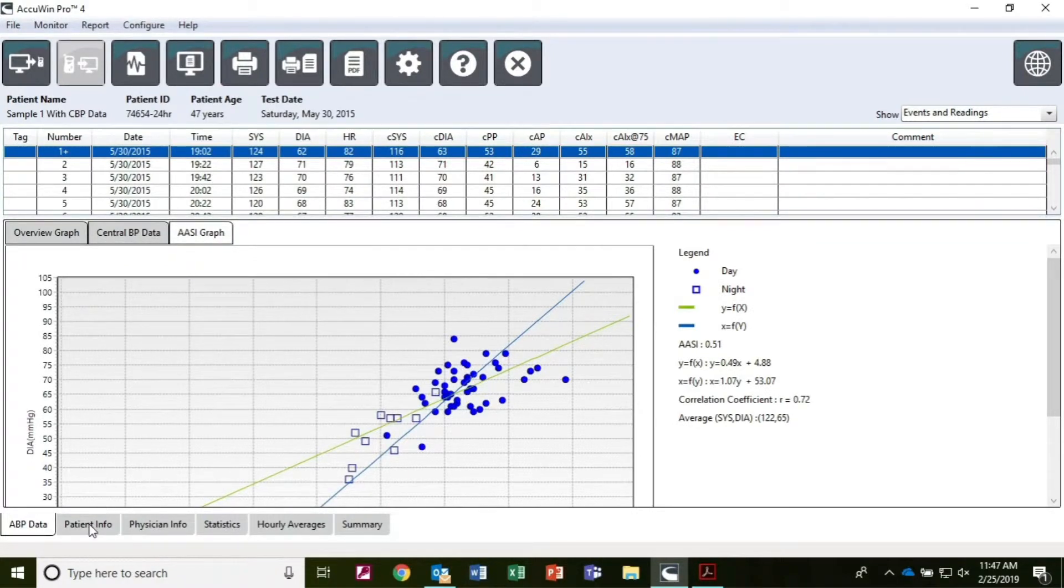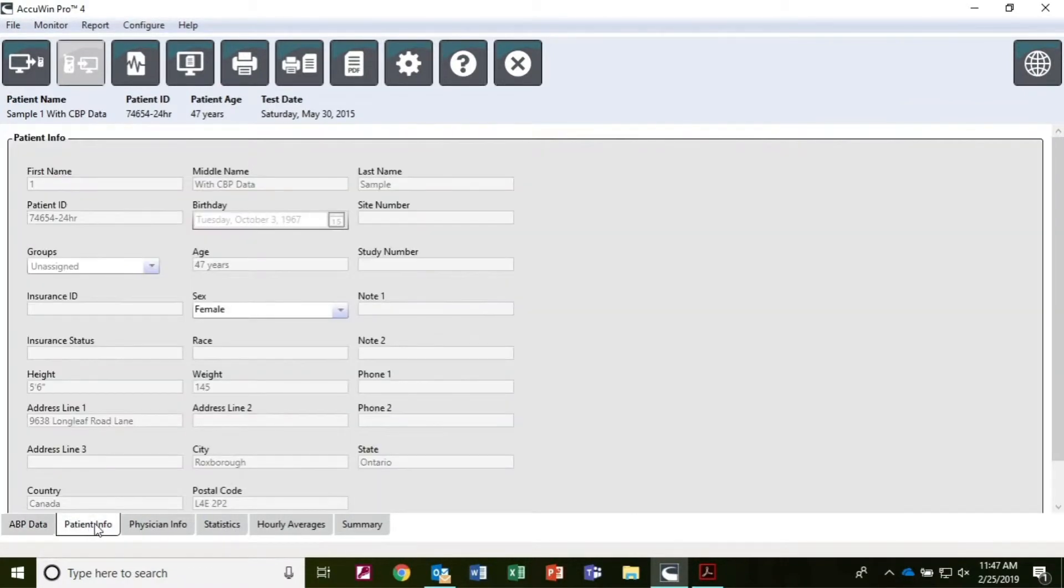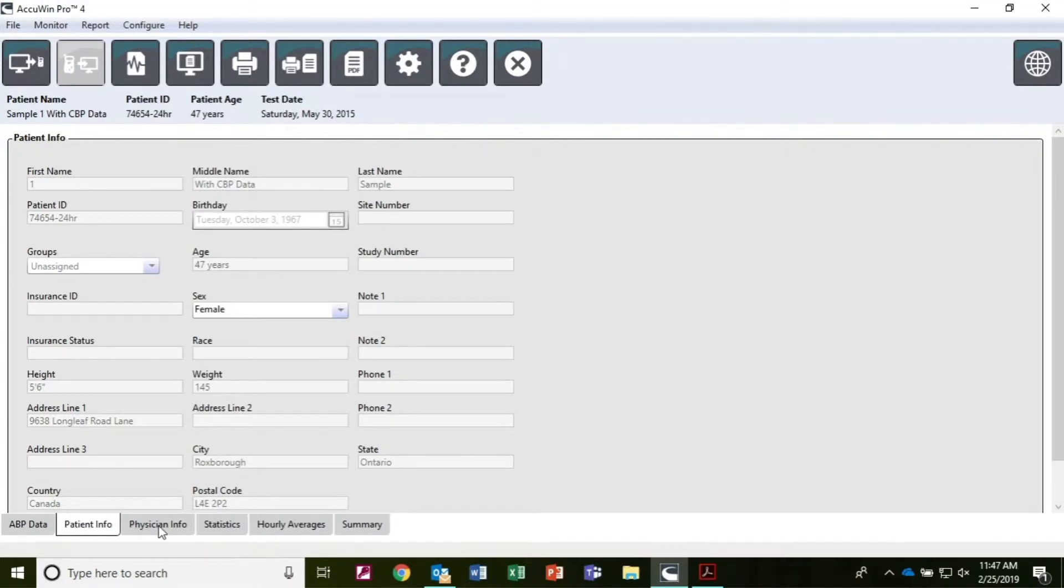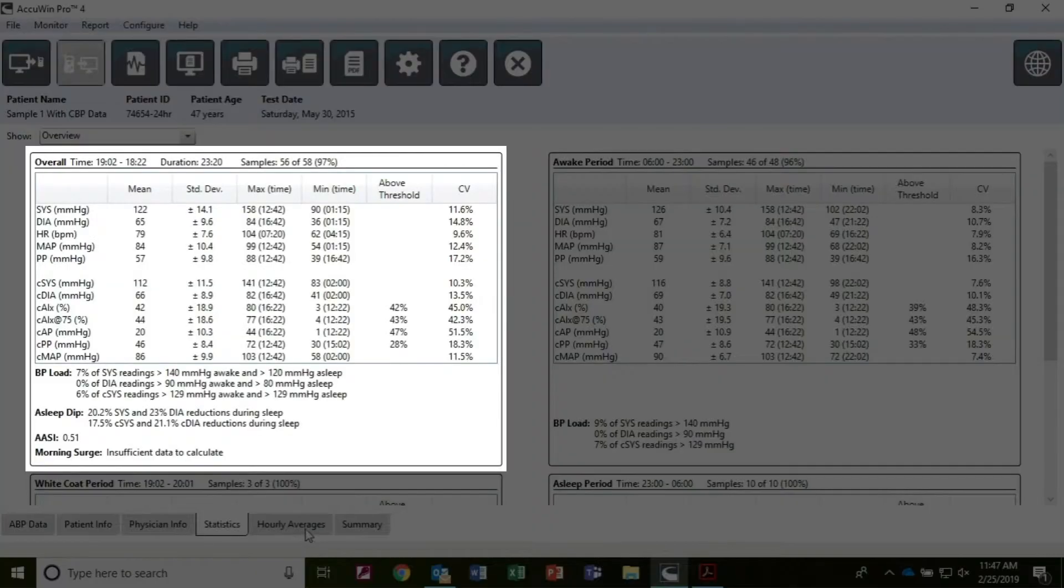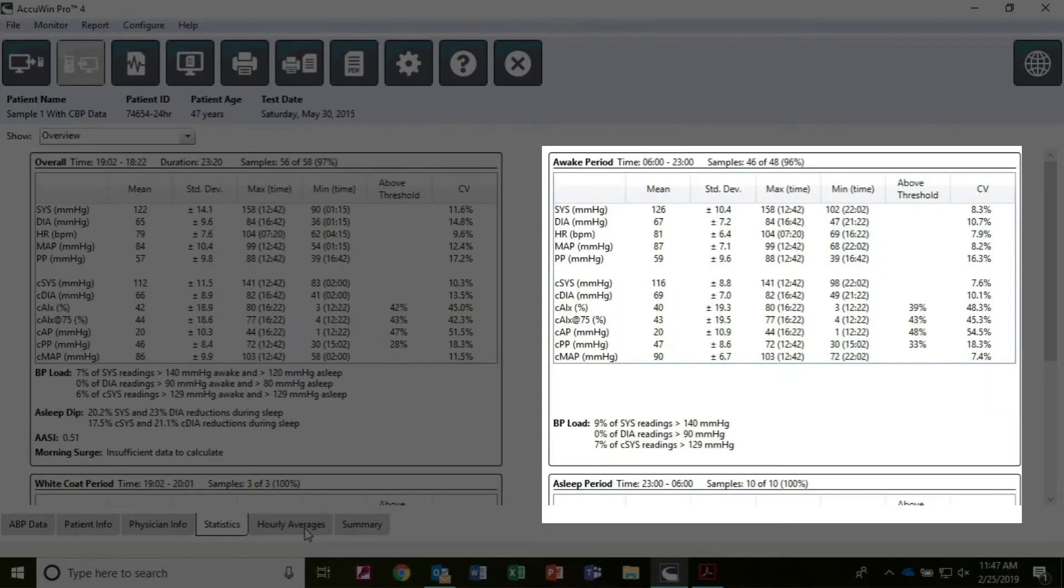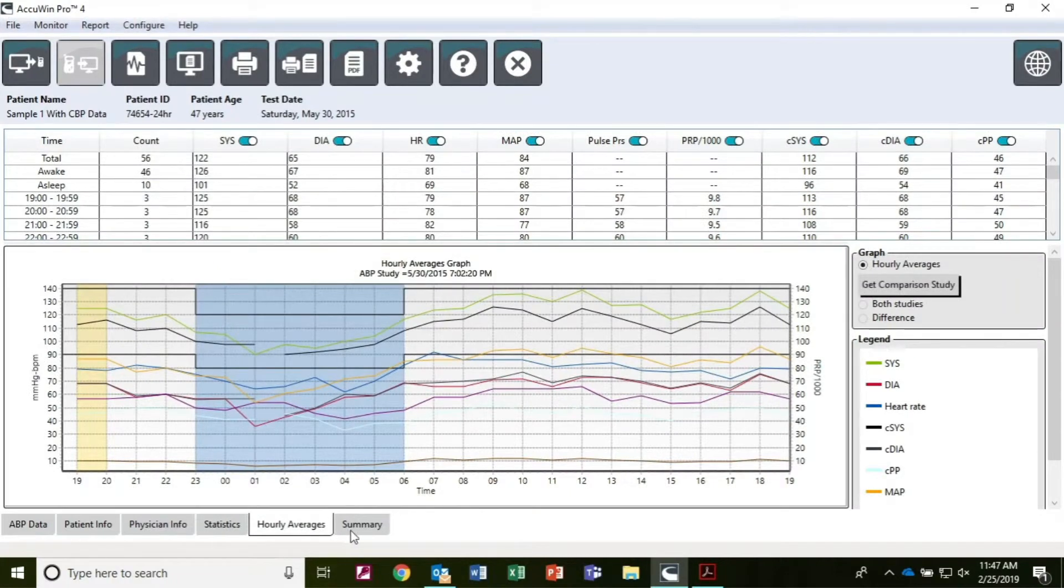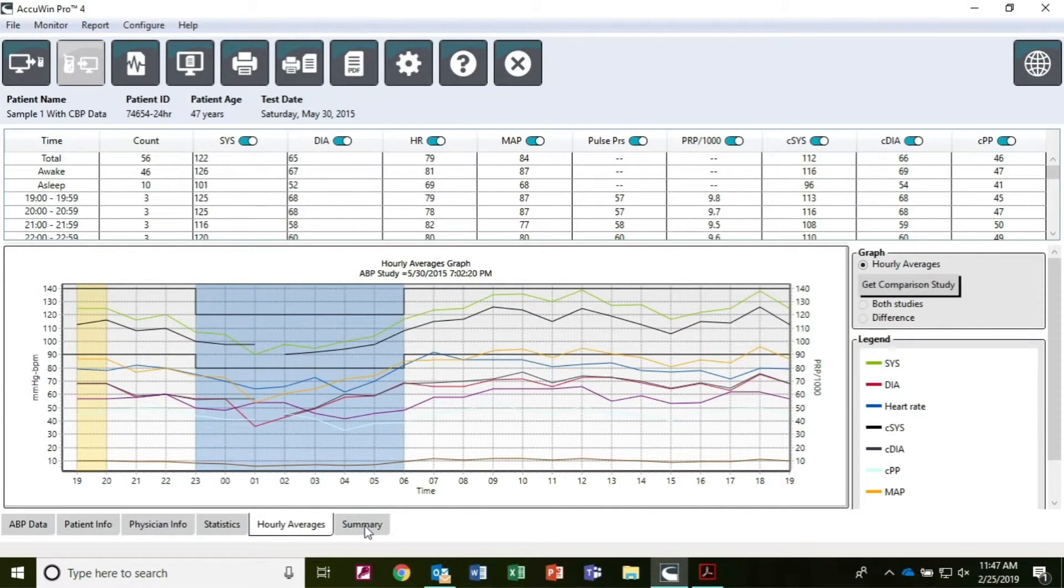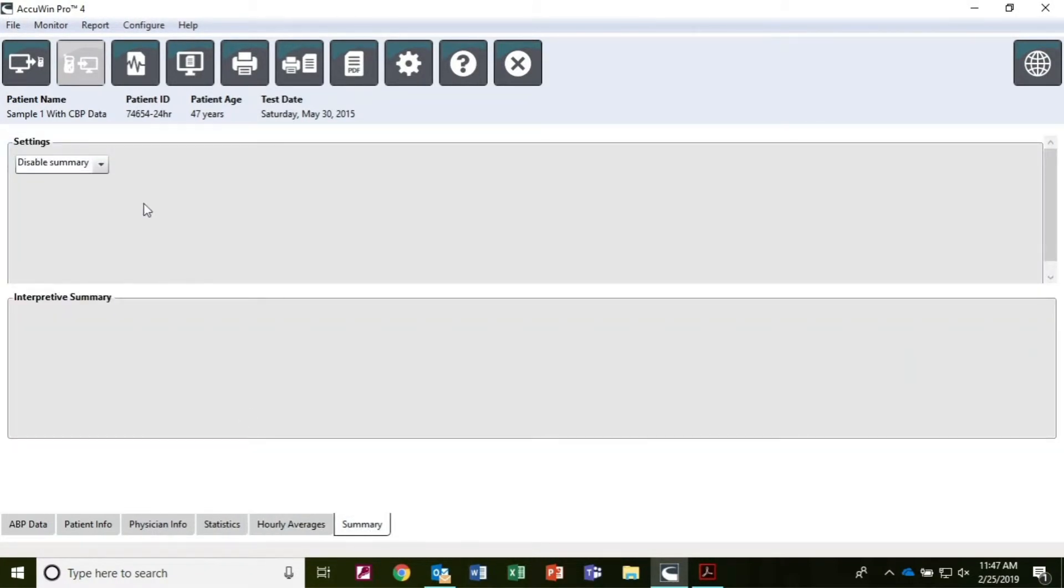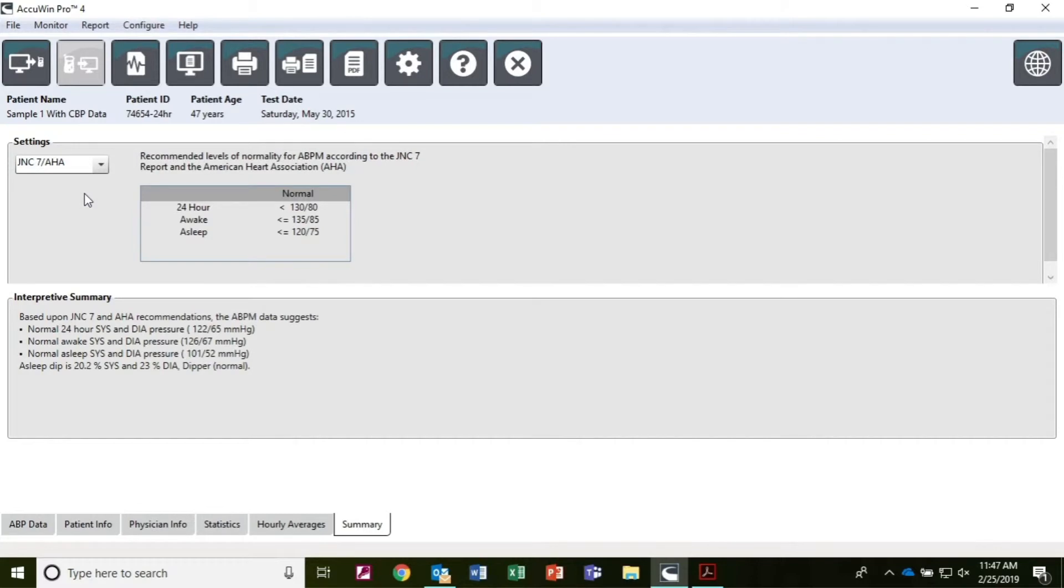Other tabs show patient demographic information, physician info and patient history, overall statistics during the study, statistics for selected time slices during the study, hourly averages during the study, and an automatic diagnostic summary based on international hypertension protocols.